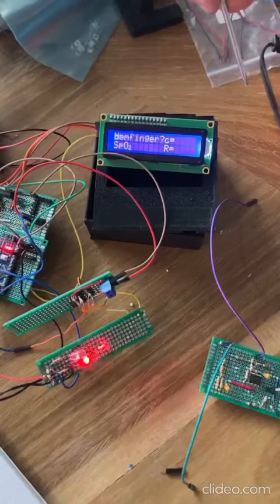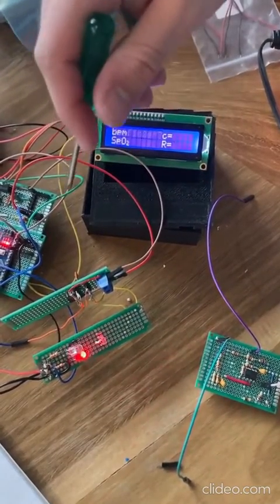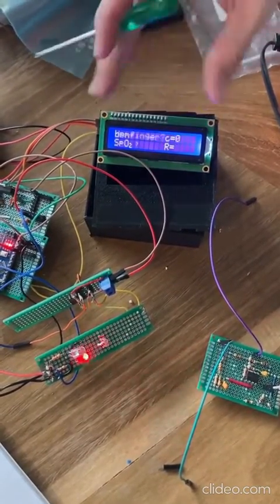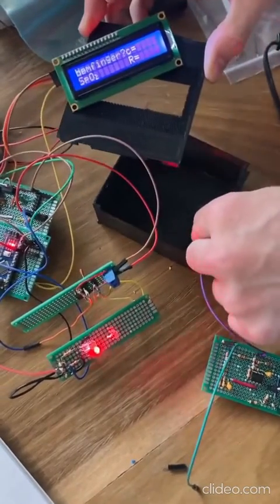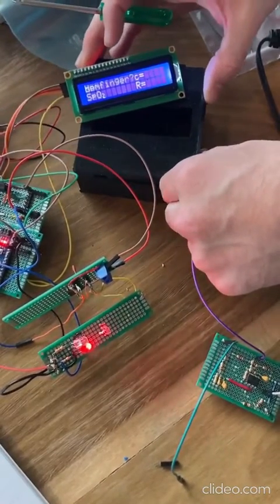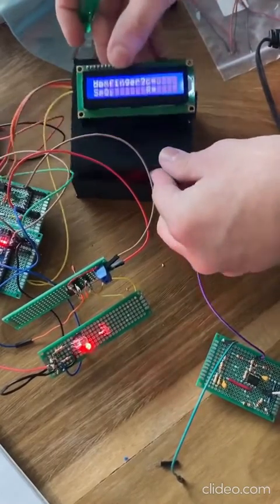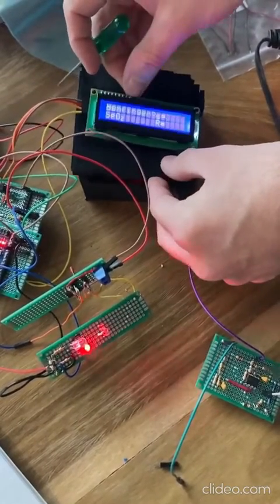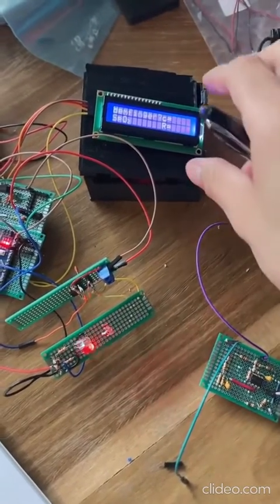Lastly, the enclosure for this whole thing would ideally be inside of this 3D printed box, as you can see here. And it was created by and designed by Ahmed. And the LCD screen would be on top.